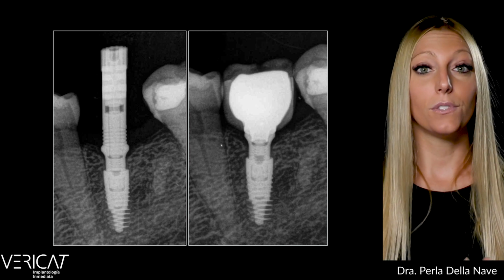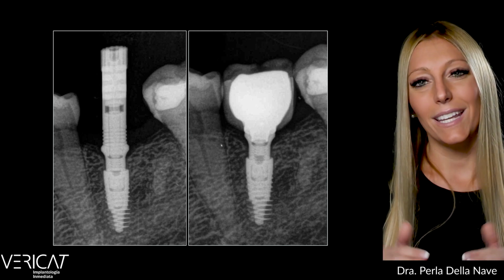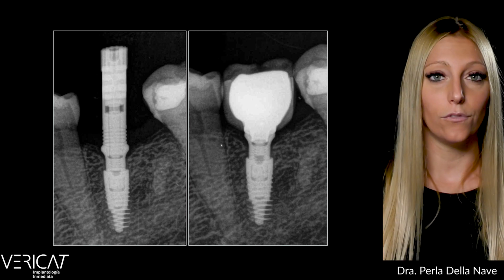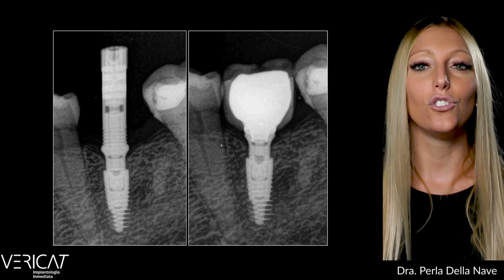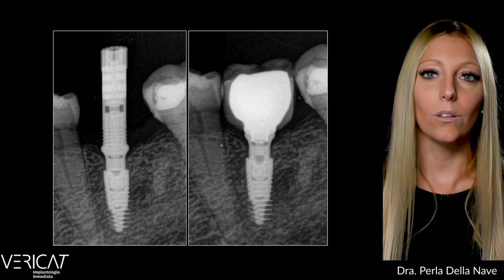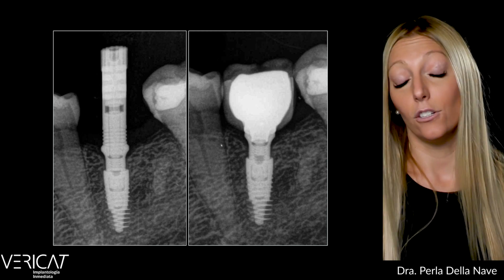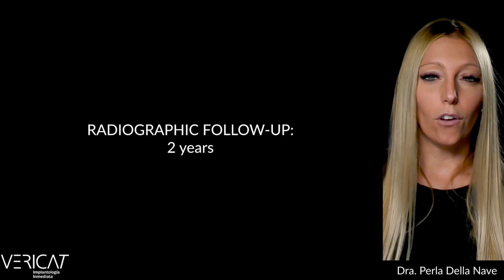However, we observe that the abutment here is lower, and the shape of the bone remodeling is slightly different, something that we also observe in other similar cases, and that does not prevent the bone level from being more than satisfactory. However, that's why we prefer to choose higher abutments, something which obviously is not possible in some clinical situations, as for example cases of limited interocclusal space. Now let's move on to cases with a 2-year follow-up.